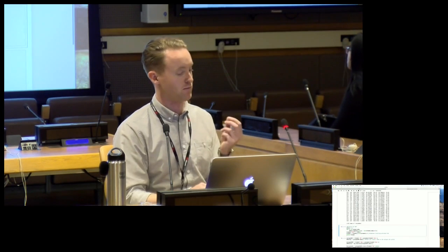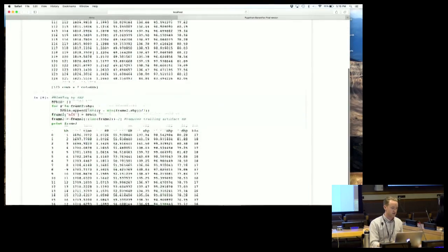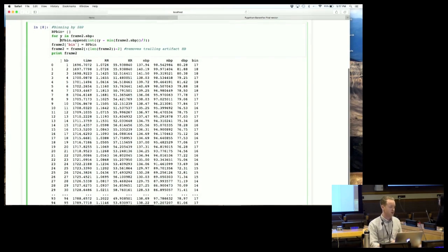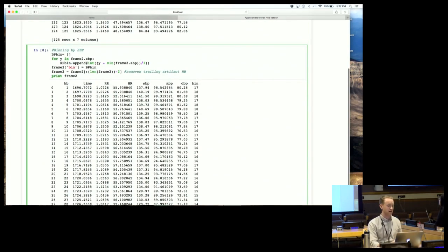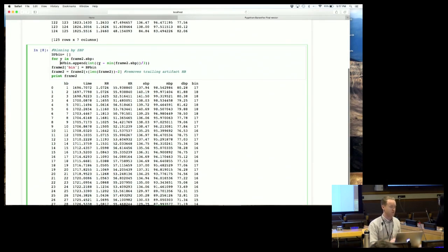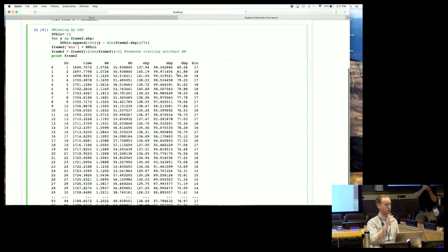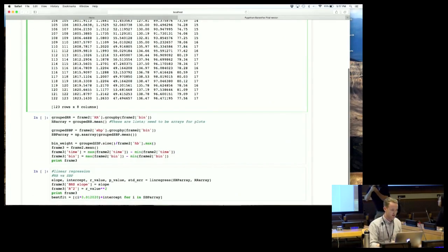To quantify how sensitive the baroreflex system is, we need to bucket the data by systolic blood pressure. We're looking at the relationship between the time between each heartbeat and the systolic blood pressure. There's a group-by function in pandas - I ended up making my own that creates 3 mmHg bins corresponding to each blood pressure range, which made more sense to me.